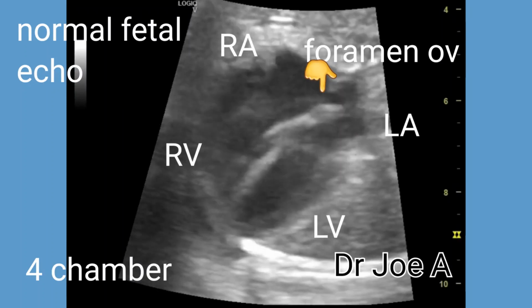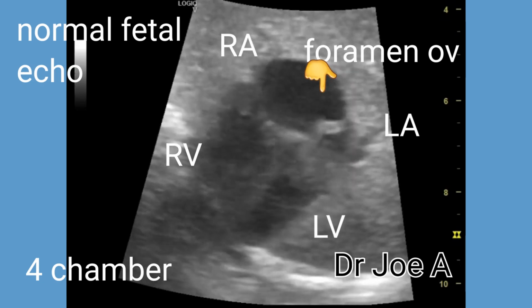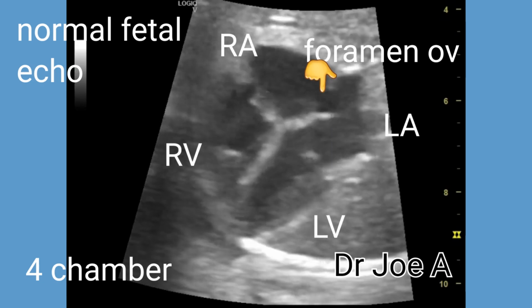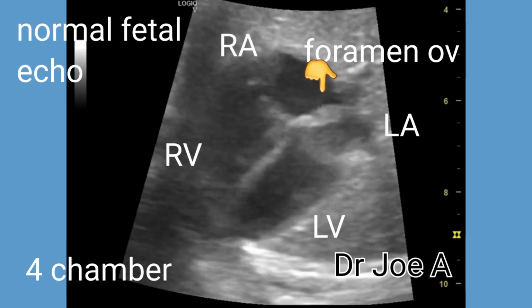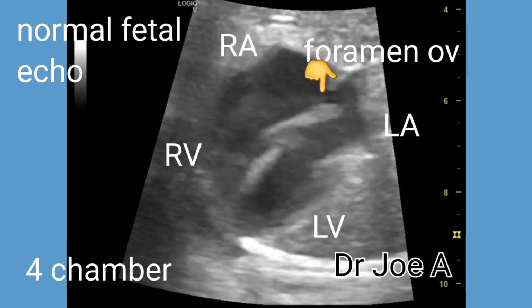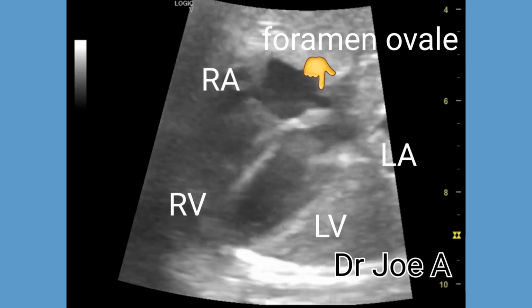This is a normal fetal echo in a late third trimester fetus. Here we study two important views in the study of the fetal heart. One of the most basic views of the fetal heart is the four-chamber view.